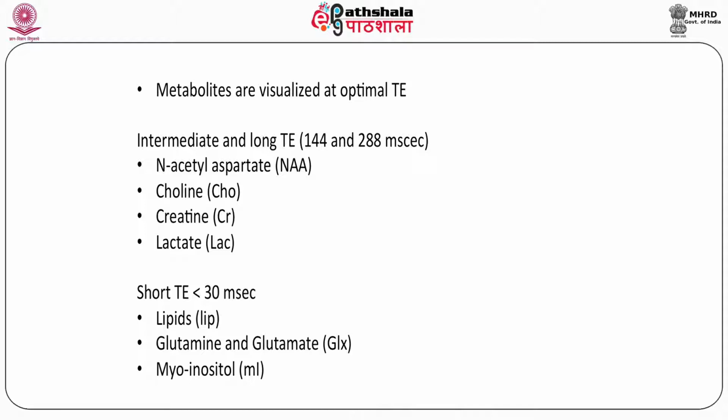Display of spectrum. This can be done in a graphical display, amplitude versus frequency, or a chemical shift imaging display, or a spectroscopic imaging display. Images of abundance of a certain metabolite can be picked up. Grayscale or color depiction of metabolites also can be seen.